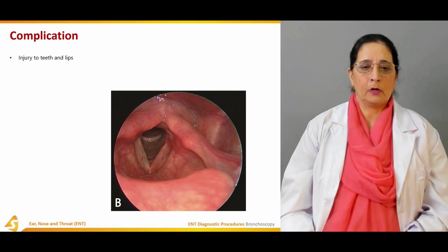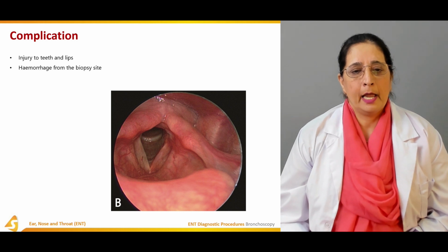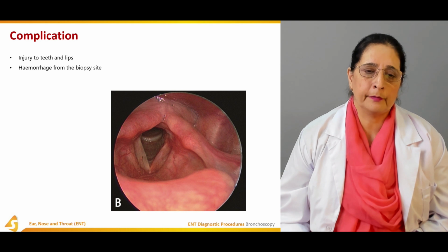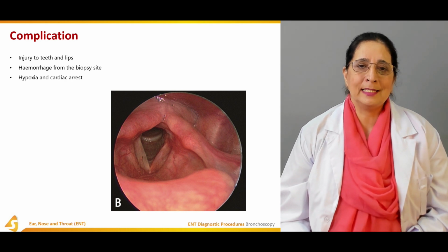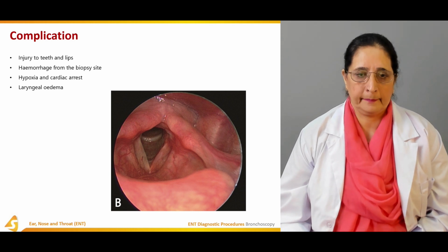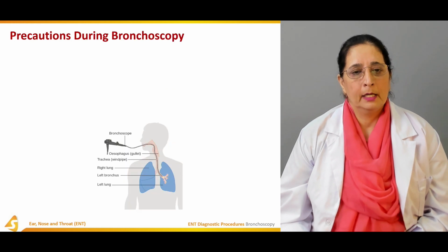Complications of bronchoscopy: injury to teeth and lips, hemorrhage from the biopsy site if biopsy is performed, hypoxia and cardiac arrest can also occur. Laryngeal edema can occur.